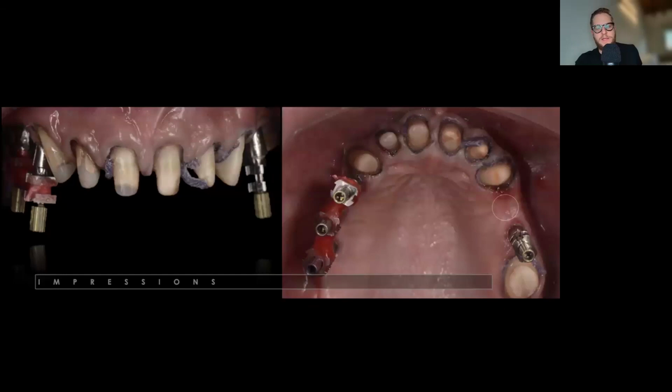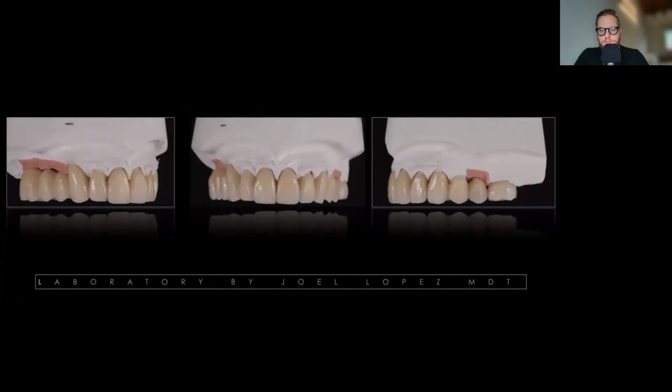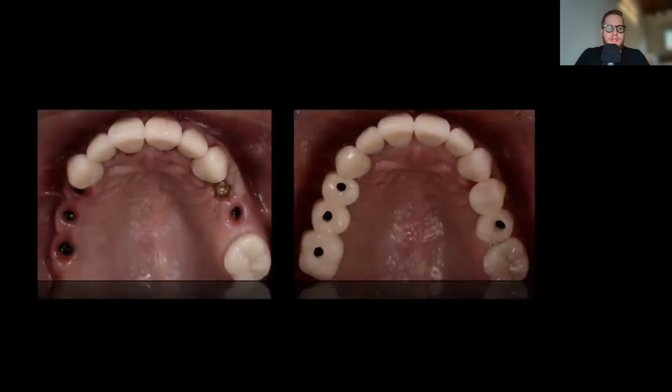So we lost an implant, but the patient was already tired of using temporaries. So we had the idea of going straight to the final restorations and only doing a temporary on that implant cantilever from the implant that was well integrated. And that way we could more or less finish the case from the anterior area that the patient was ready to finalize. And we replaced the implant. You can see now we have an implant over there in that area.